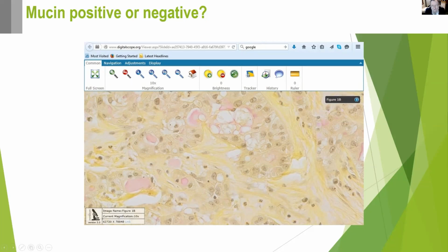All right, you have an unknown slide, and it's a virtual slide. I keep saying this. Zoom in, zoom out, pan right, pan left, up, down. Search the whole slide. Find the region that has the stain, or look at every possible corner to determine that it doesn't have the stain. And then you go through the story. In this particular story, one resident says, I use TTF1, which is a different stain, thyroid transcription factor 1. He says it also stains for adenocarcinoma.